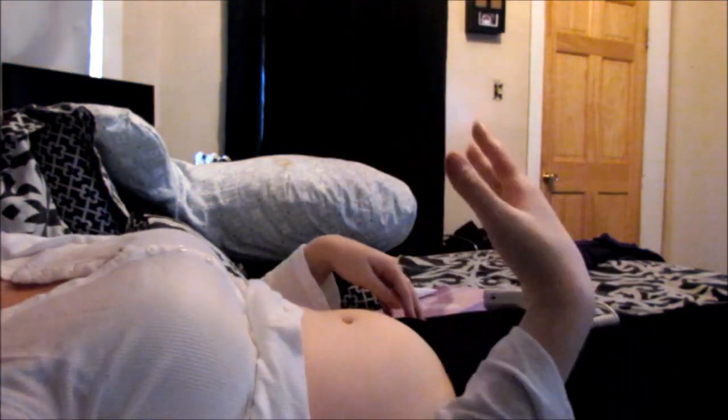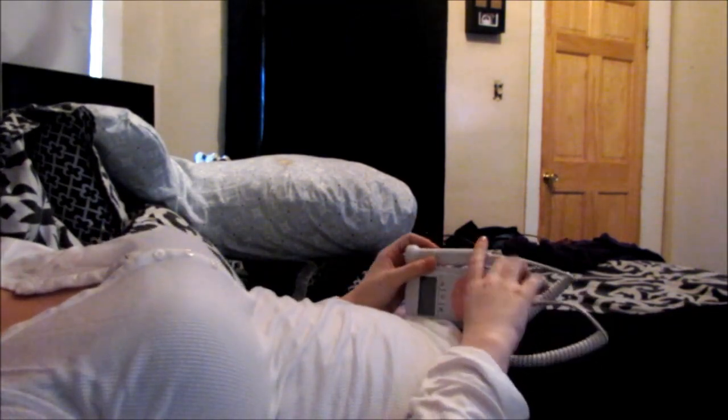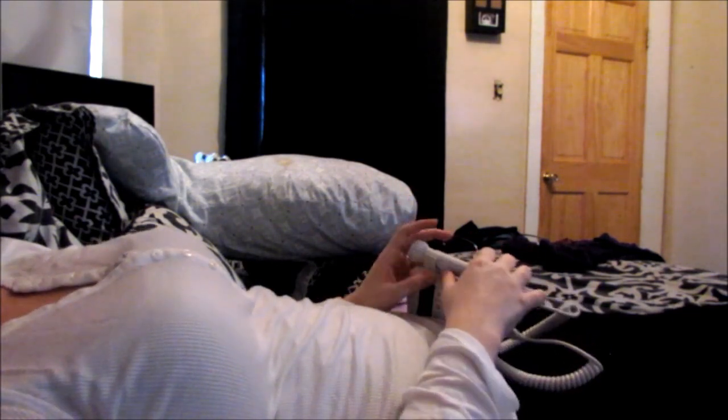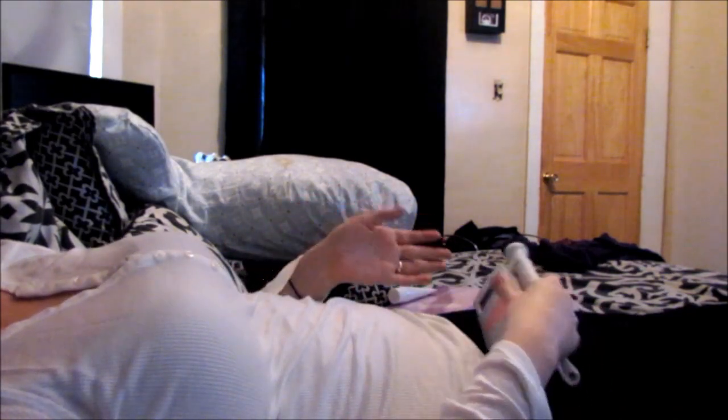So it takes a lot of practice to find it, and especially if you're early, don't get discouraged, because I found it the first day. I had my Doppler, but it took 4 tries, and then after that I couldn't find it for another 3 or 4 days. So really don't get so discouraged, like, oh my god, I'm never going to find it, because you're going to find it eventually. You just have to practice and know what you're looking for and know what the baby sounds like.